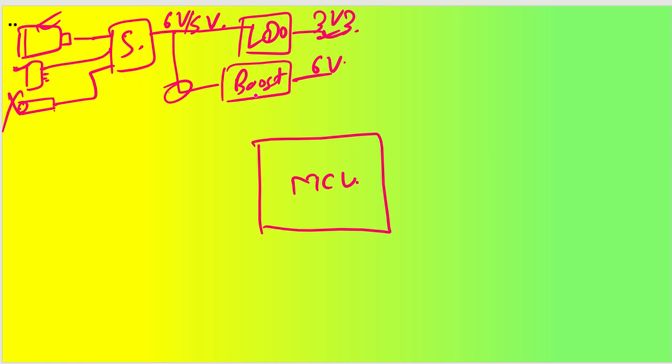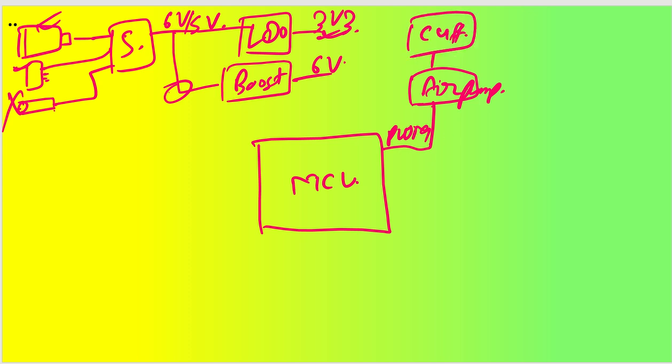Now coming to the fact that we will have one air pump. In that, this will be the pump, this will be the motor that will be working. So for that we will have one connection through the connector. This will be driven through my PWM signal. This PWM signal will be switching this air pump off and on, because we will be giving one switching circuit here. Now this air pump is going to get connected through the cuff that is connected to the arm. This is how it is going to work.